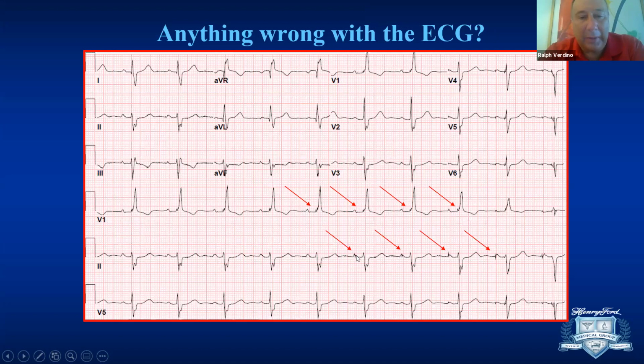So I'm not positive. It certainly seems that the first ones are appropriately sensed, and it seems that the rate seems to be, maybe picking up a tiny bit. So I'm not positive. Exactly. That's a good possibility. Again, it goes with the fact that, remember, the pacemaker takes time for it to be sensed, you going through the circuit. So you're right. I mean, it could be because of that reason, the rate has changed just slightly. But I was using the example just to show how an atrial undersensing might look like. But you're right, given the change in rate, yes.